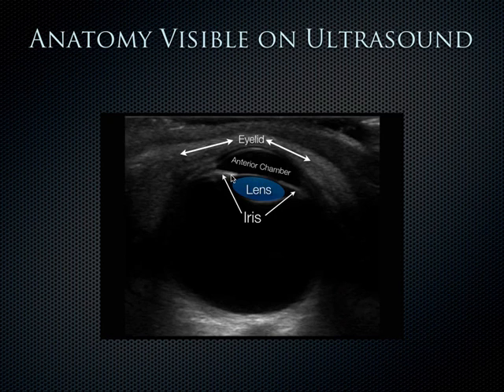And so what happens is when you shine light in the other eye, the eye that's open, you can actually see this iris constrict, and the pupil will constrict because this structure here and this structure here will move towards one another. And then you want to look in the posterior segment, sometimes called the vitreous body or vitreous humor, and then behind that is the retina attached down at the choroid. And actually behind the retina, you can see a little piece here of the optic nerve sheath coming down as well.